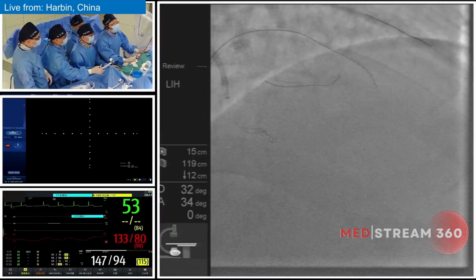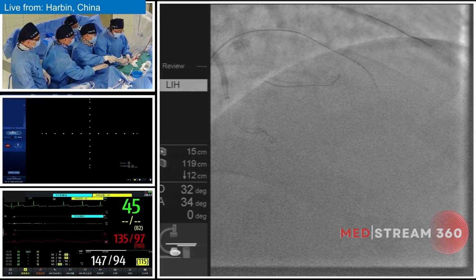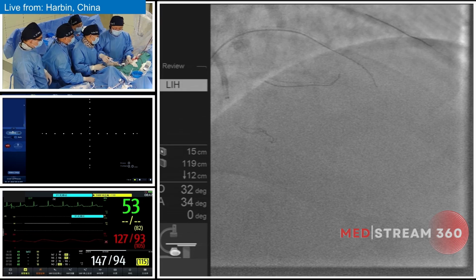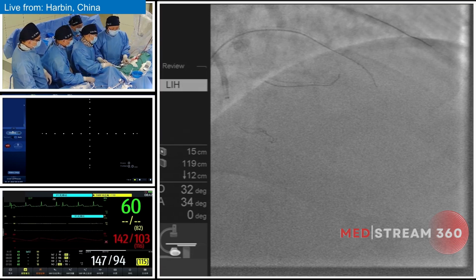The second diagonal is still at the distal part of this Stingray balloon, so reentry at the current spot doesn't influence too much of the perfusion of the myocardium from the left ventricle.